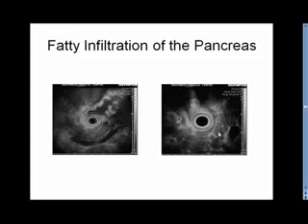and also with higher ultrasound frequencies, you see this lobulated appearance and a septa of fat going through the pancreas and giving it a marbled appearance, lobulated appearance. So this is not chronic pancreatitis, it's just fatty infiltration.